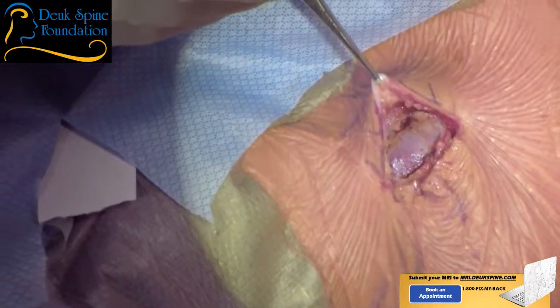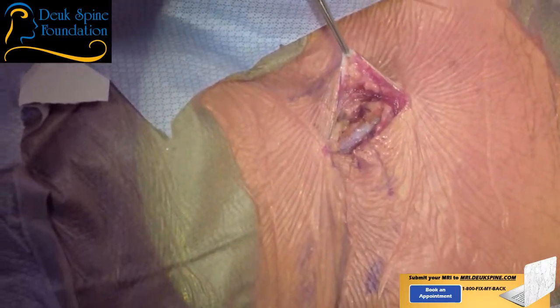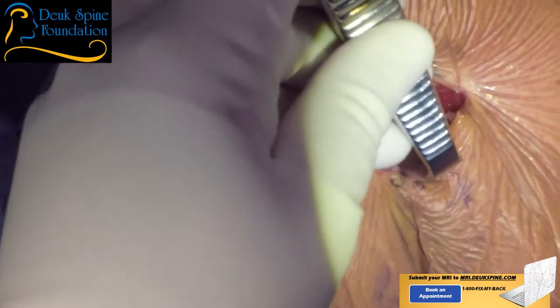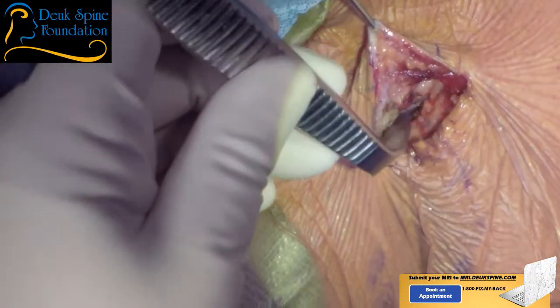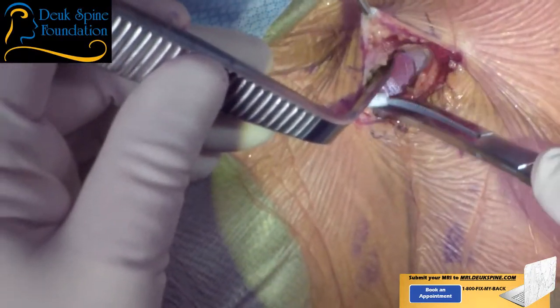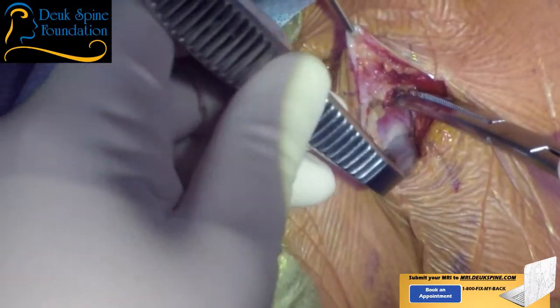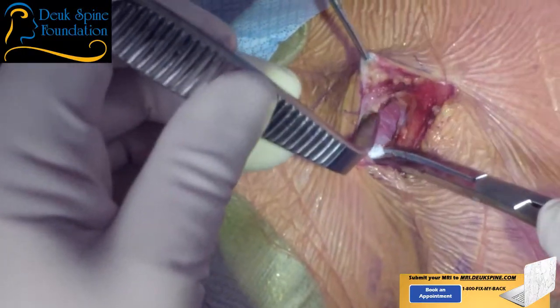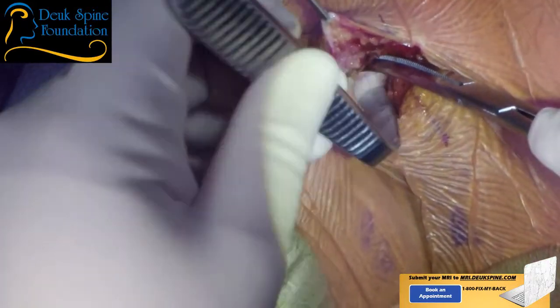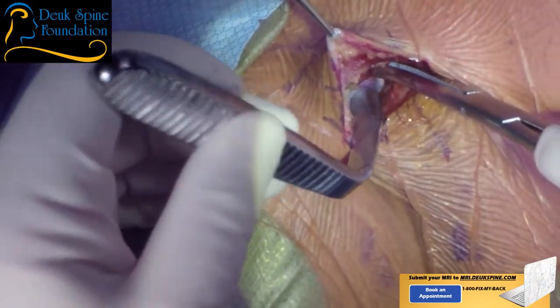I need a lipless. So at this point, when I see the omohyoid, I like to go above it at the top margin. I use a lipless retractor along with a kitty, which Luis knows. And there's that spot that I like to go right there, just north of the omohyoid, trying to preserve the omohyoid. Preserve means not cut or injure. And again, we are just medial to the carotid sheath.